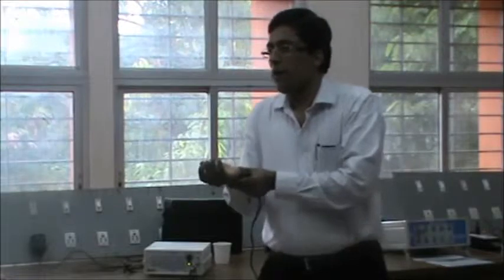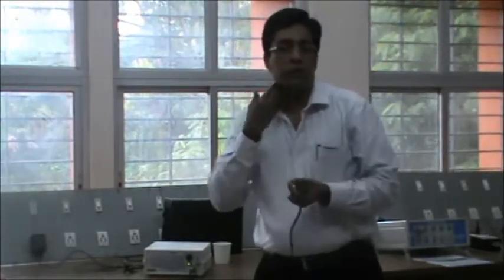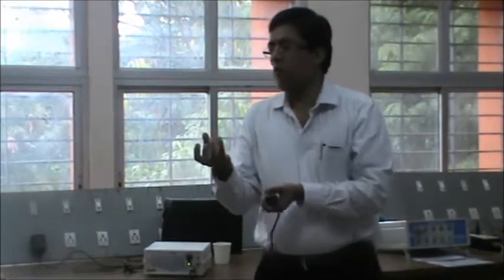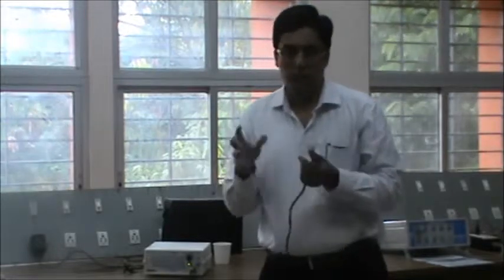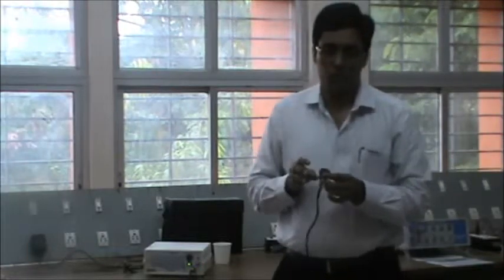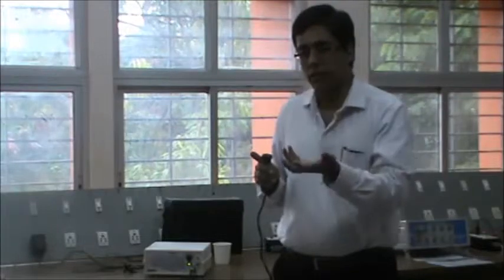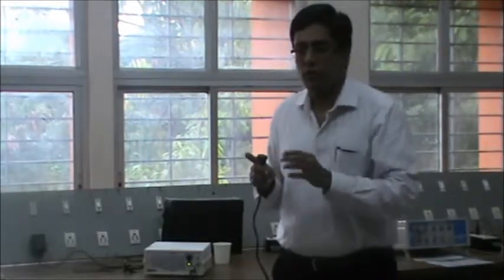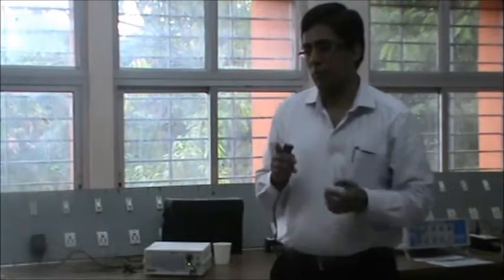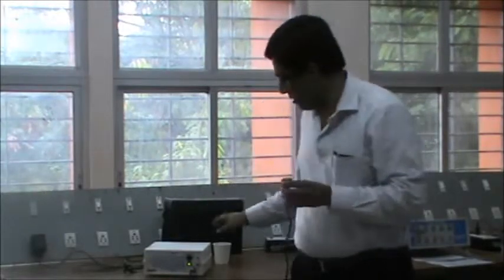Just like obtaining blood flow information, blood flow velocity. You can place it over your jugular or carotid arteries or your veins and obtain the information of the blood flow. I am just giving you an example. Whereas 2 megahertz cannot be used for that, because it just cannot do that. With high frequency you have high sensitivity but not much penetration power. With low frequency you have less sensitivity but maximum penetration power. So it is kind of inversely related.